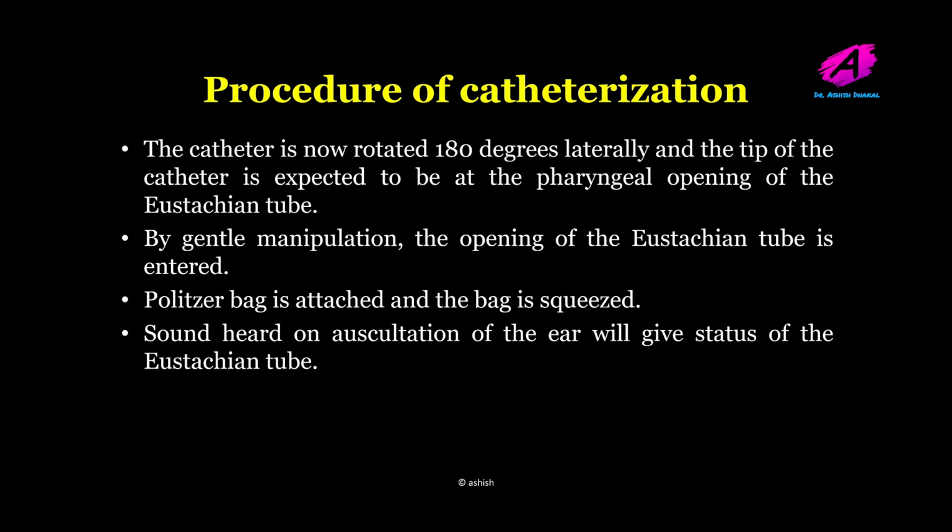Now the Politzer bag is attached and the bag is squeezed. The sound heard on auscultation of the ear will give the status of the Eustachian tube.